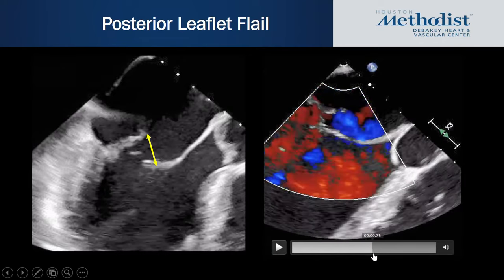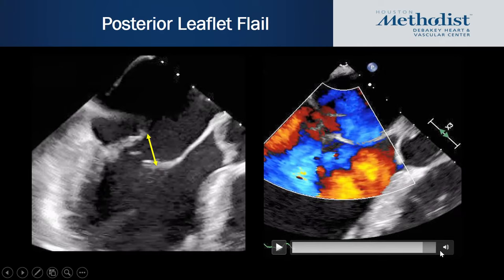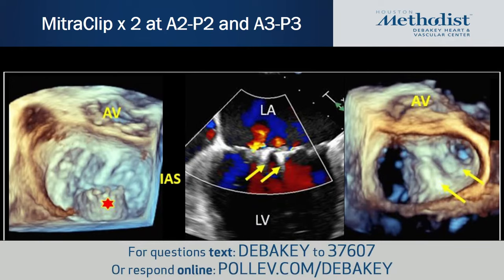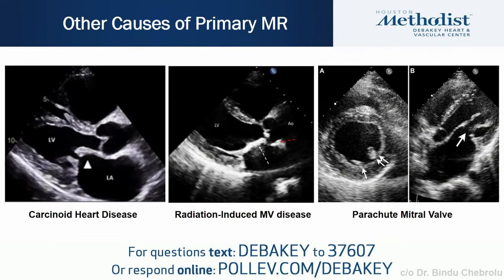An example of a posterior leaflet flail leads to significant and eccentric, anteriorly directed mitral regurgitation. This patient underwent mitral clip implantation given high surgical risk. The 3D image shows the P2 and P3 flail, and the patient underwent implantation of two mitral clips with significant reduction in mitral regurgitation. Other causes of primary MR include carcinoid heart disease, characterized by endocardial plaques of fibrous tissue affecting the leaflets and subvalvular apparatus, causing a coaptation defect.